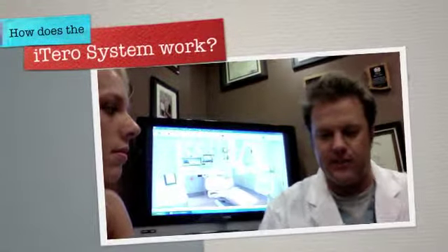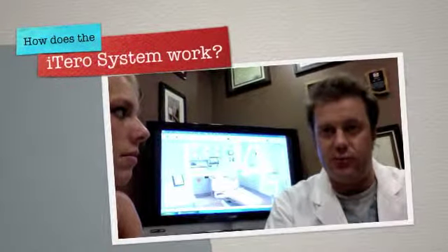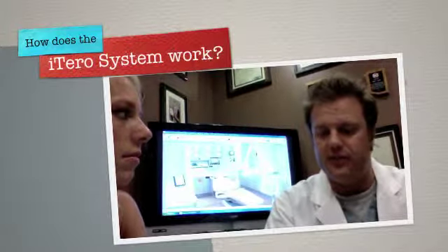Tell me how the iTero system works. The iTero is CAD/CAM software, computer software. You basically drill the tooth, shape it into the shape that you need, and then use the iTero to scan the tooth in, and the computer software will design a restoration for it.